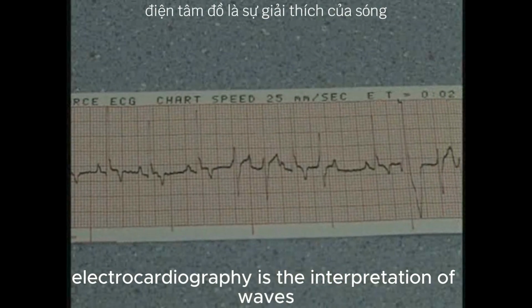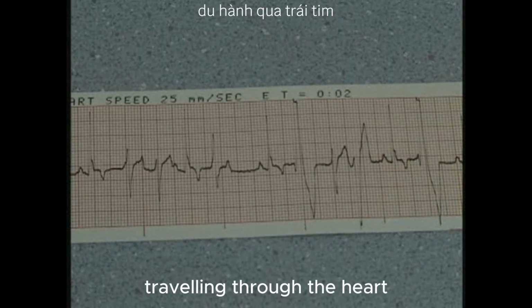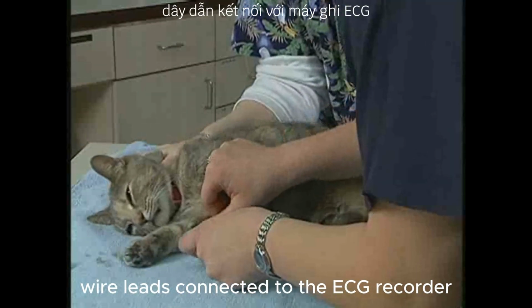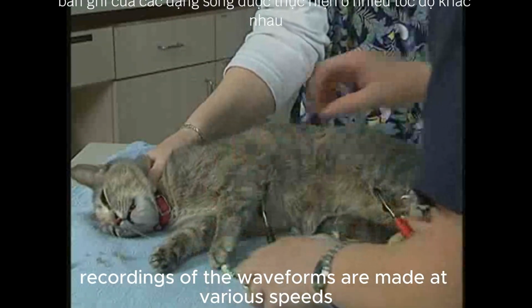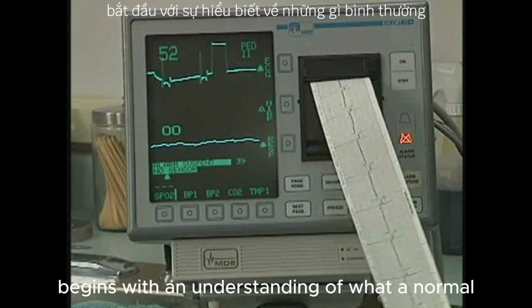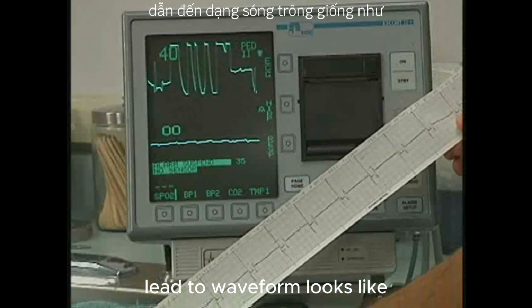Electrocardiography is the interpretation of waves produced by electrical impulses traveling through the heart and recorded by an electrocardiogram, or ECG. Wire leads connected to the ECG recorder are attached to the patient. Recordings of the waveforms are made at various speeds and through different lead pathways. Interpreting the ECG waveforms begins with an understanding of what a normal lead 2 waveform looks like.